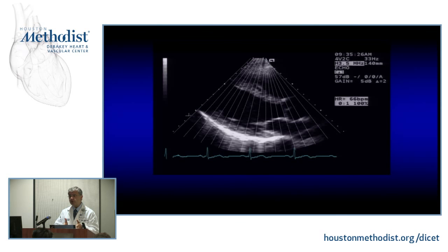And there are some issues with that, because obviously you could see how tight these lines are close to the transducer and how wide they are down there, right? So that's important from a lateral resolution point of view. And it also tells you that because I have to scan, for me to be able to see this as close to real time, there is a certain frame rate that you have to deal with. So it has lesser temporal domain than an M mode, for example.